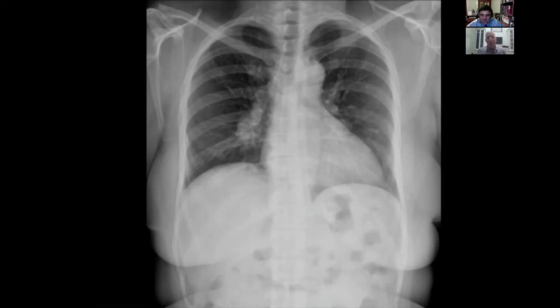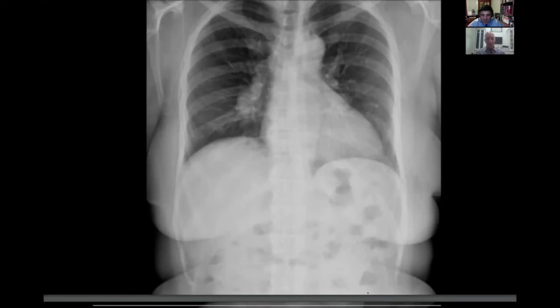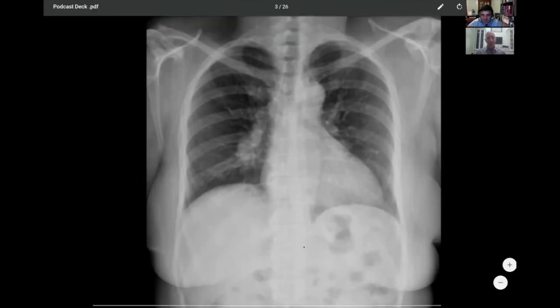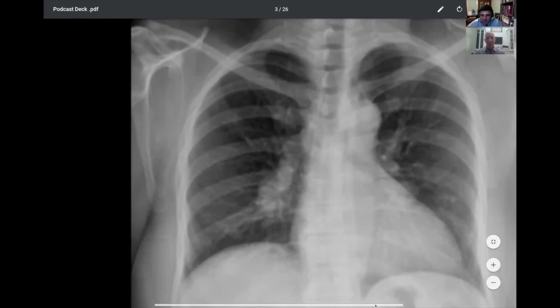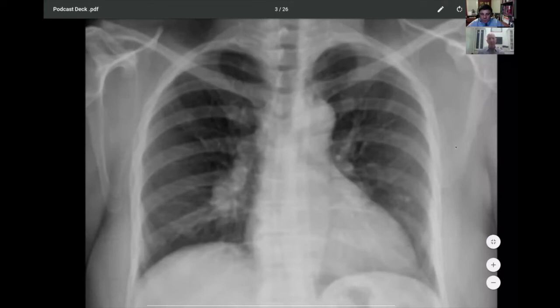As radiologists, we can get a little bit nitpicky over technique on exams, and reading from as many different locations as we do, we really see a gamut of types of technique and positioning and so forth. And this case came across, and just to point out, you could see how far down this image actually went. This is almost to the iliac crest here. So that's never good. Not only does it increase the radiation exposure to the patient, but it really decreases the resolution and magnification in the important field of view. If I mag this up just a little bit, you can kind of see that this is more how the chest X-ray should have been collimated to begin with. Sure. So I'm gonna leave it like that for you to take a look.